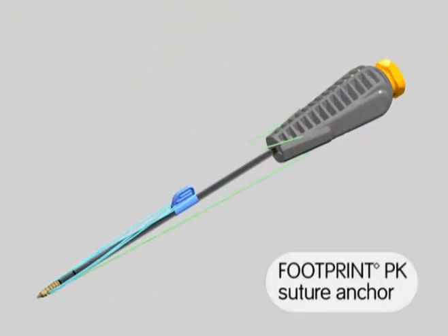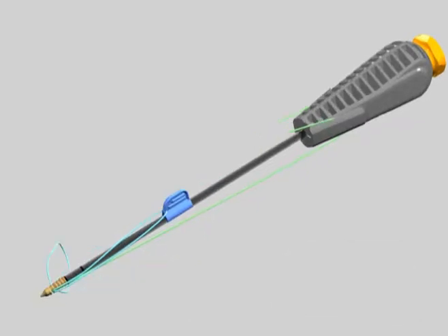While holding the footprint anchor inserter handle, push the suture threader tab forward towards the anchor, releasing the suture threader loop.